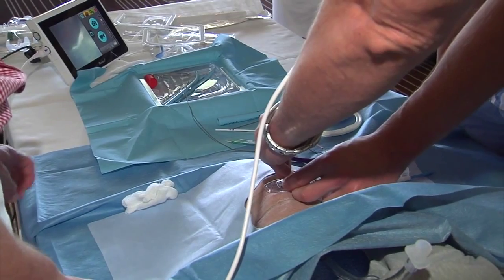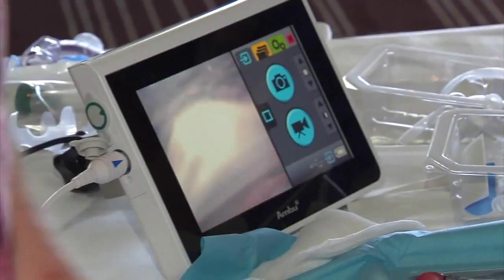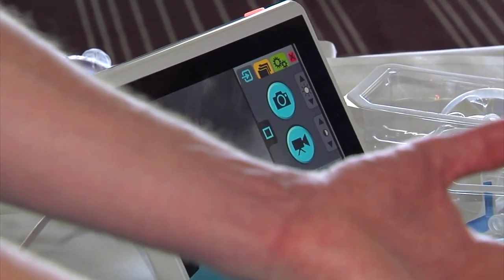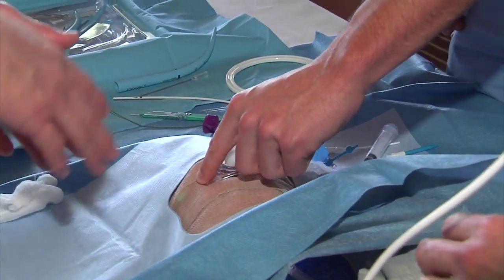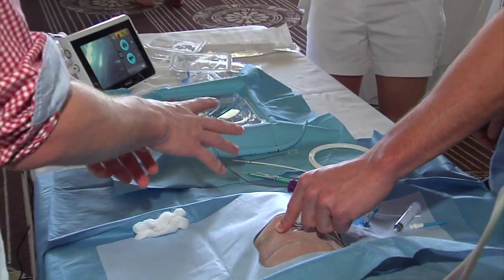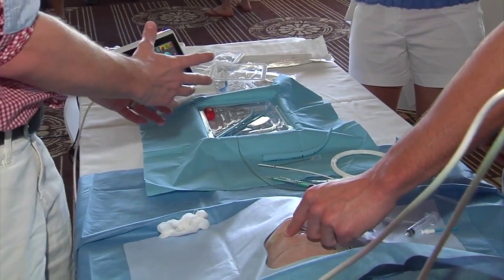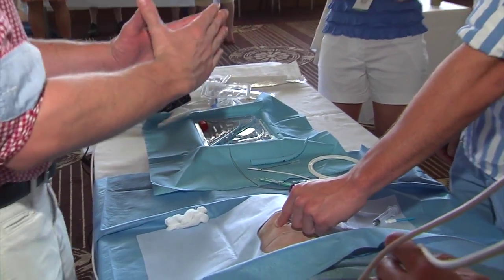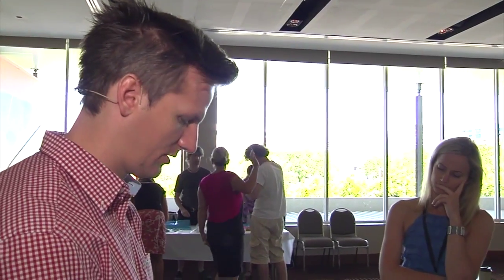John goes down and checks that it's in the lungs — that's what the lungs look like in this model. You're also suctioning up blood and sputum created during the procedure. Hook on end-tidal CO2 so we know we're definitely in. Then John puts his bronchoscope back up through the ET tube and goes just above the cuff to suction up any secretions so they don't go down into the lungs when the cuff deflates next. He then looks at the vocal cords to assess any damage, and does direct laryngoscopy at the end to grade the airway, which will be part of the tracheostomy documentation sheet.